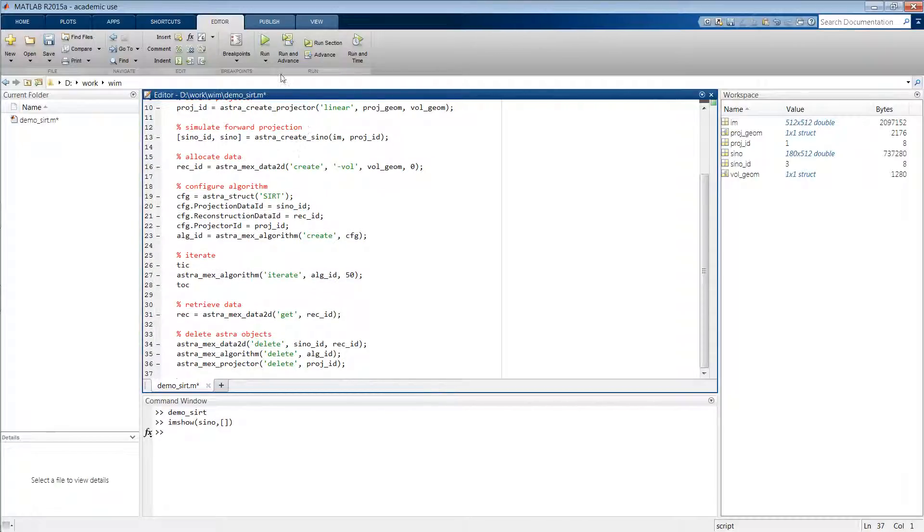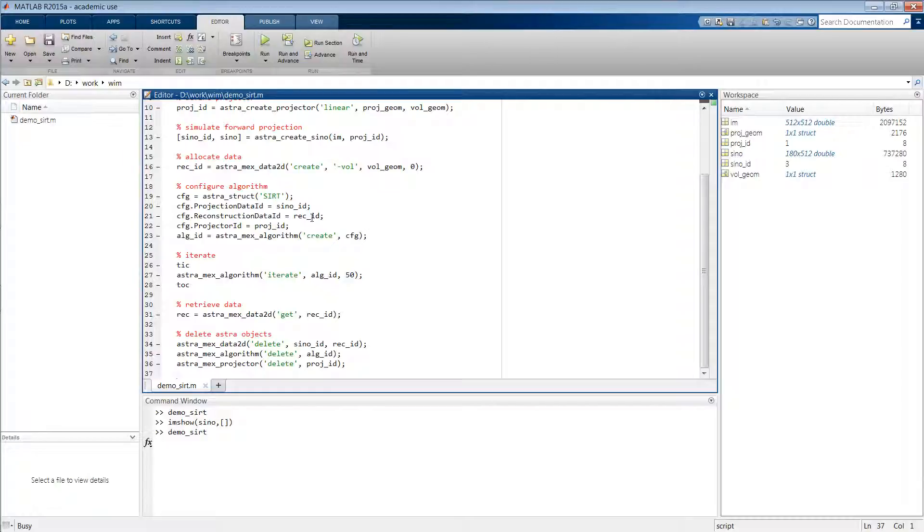So this is it. We can now run this script and it will then configure and start iterating our SIRT algorithm, which should take a few seconds.